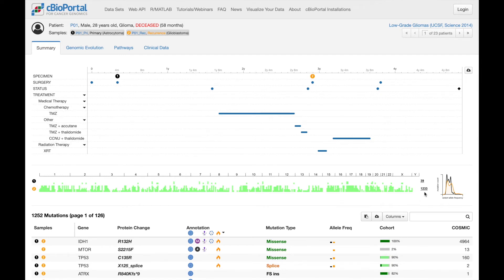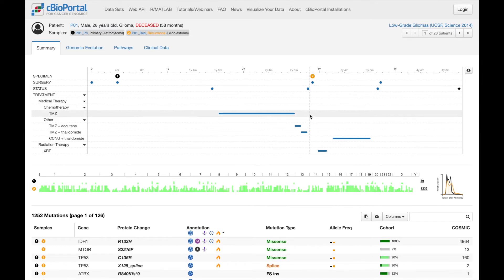For example, this second sample is hypermutated with over 1,200 mutations, and we can see that it was actually sampled after the patient received temozolomide, which is a mutagenic chemotherapy.